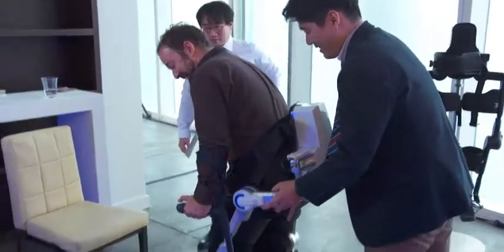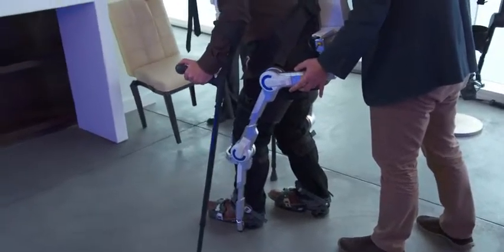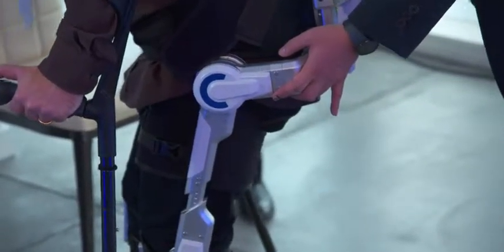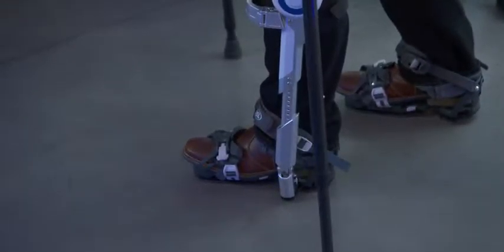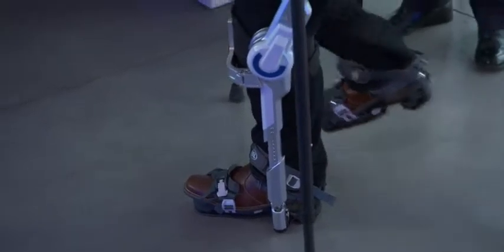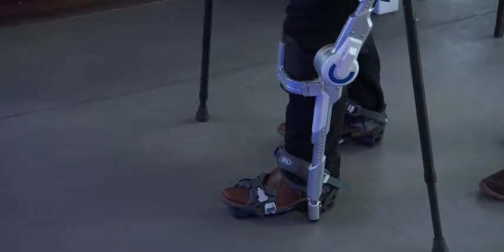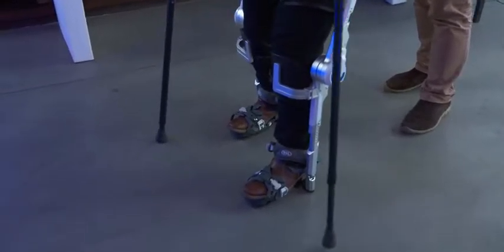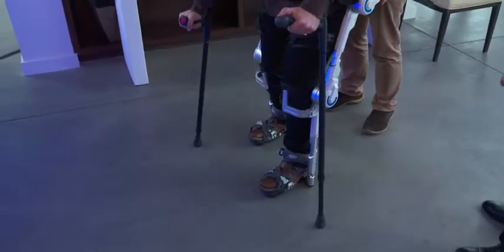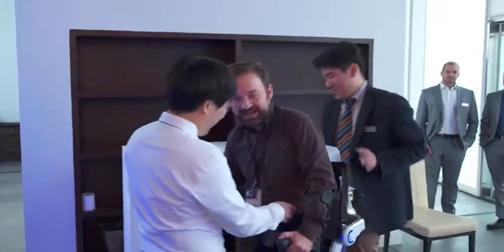Okay, and step back. It's not hard — it's quite easy, just a rebound. Just lean forward. This is awesome! I feel like I'm learning to memorize this. I think your butt is too far backward. The hardest thing is remembering which leg moved last.